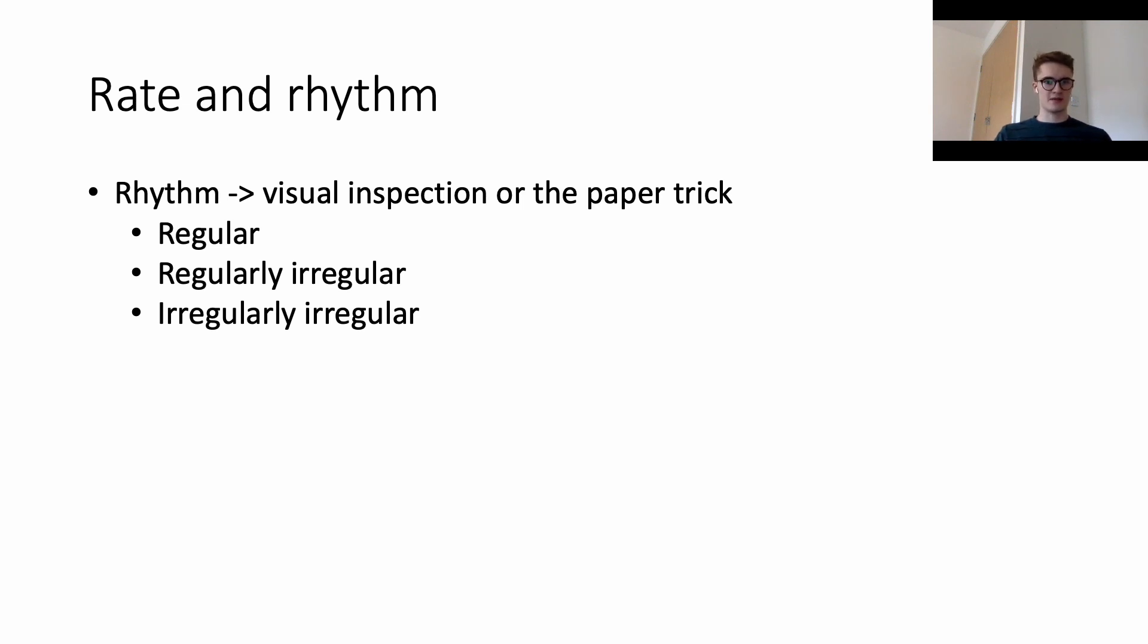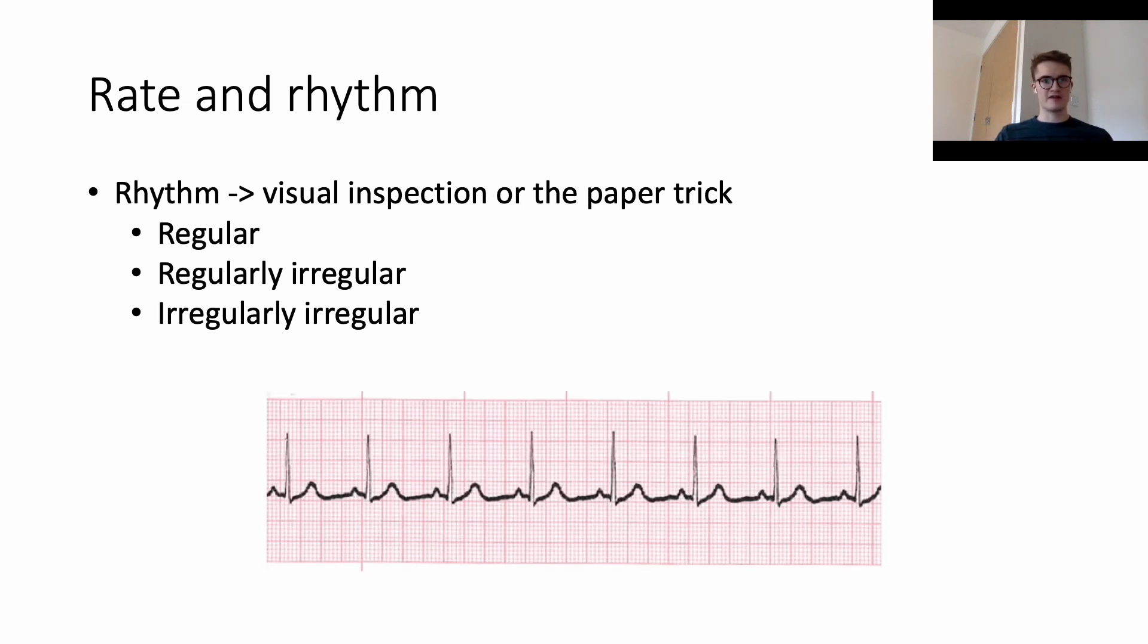Let's look at three examples now. This is the first example. On visual inspection, I would look at that and say it looks quite regular to me. I would say that the gaps in between the QRS complexes look quite even, so I'd say that's regular. We can check that with the paper trick. We've drawn an arrow representing the distance between these two QRS complexes, and then we move that across and see, does it match across the whole width? Yes, it does. That is a regular rhythm.